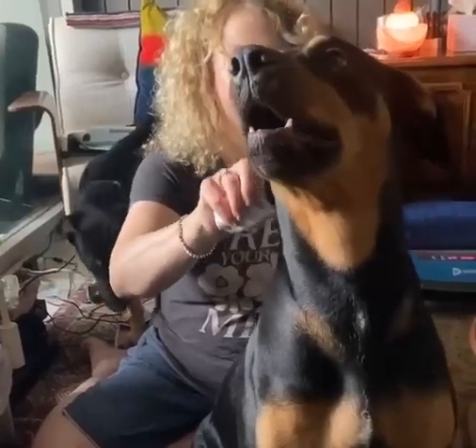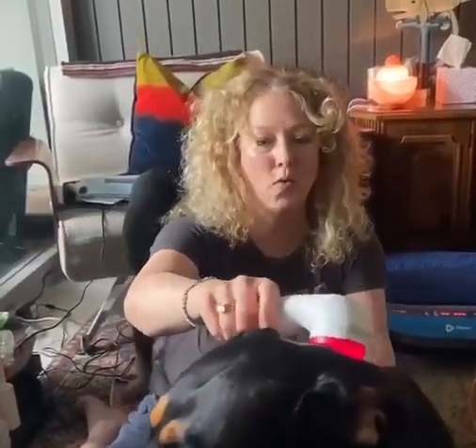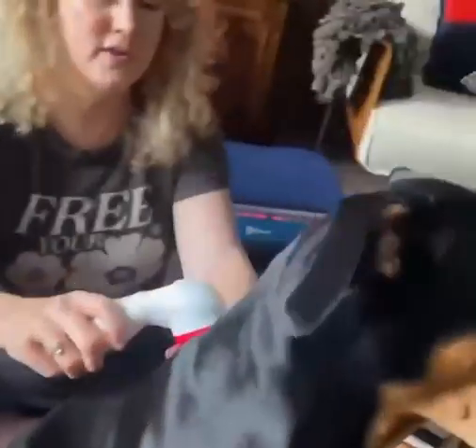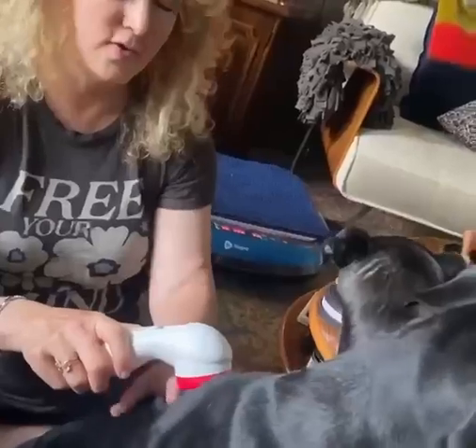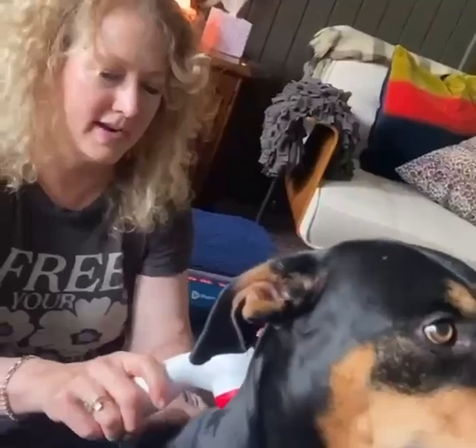I end up getting a lot of dogs who have mobility issues, whether it's spinal issues such as DM, IVDD, or they have hip dysplasia, issues with their stifle joint, issues with arthritis, and I'm using a Domer Laser on Artemis Lilith right now.